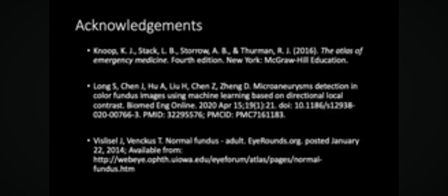That concludes this module on fundus photography interpretation.